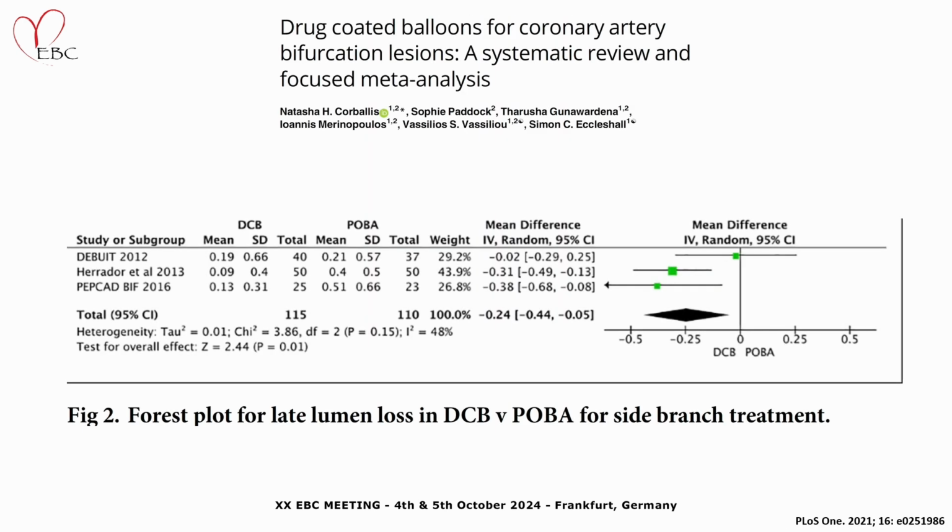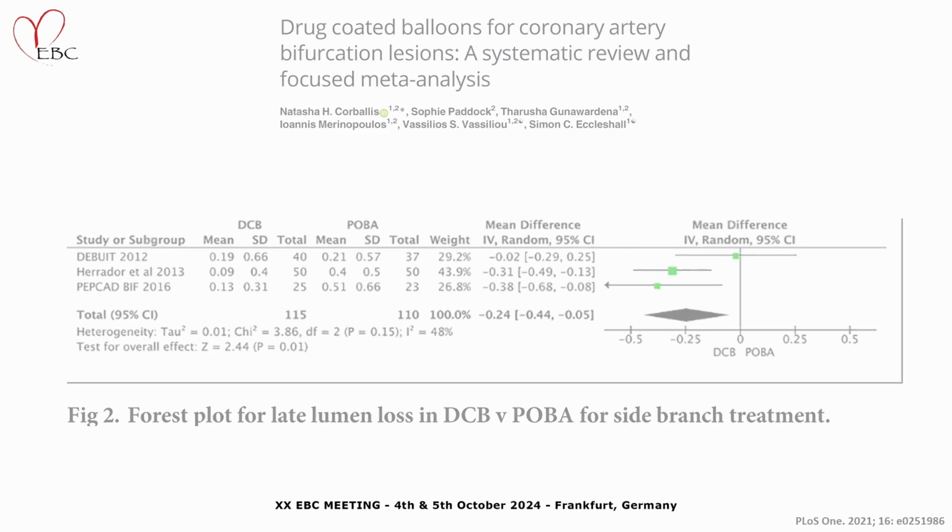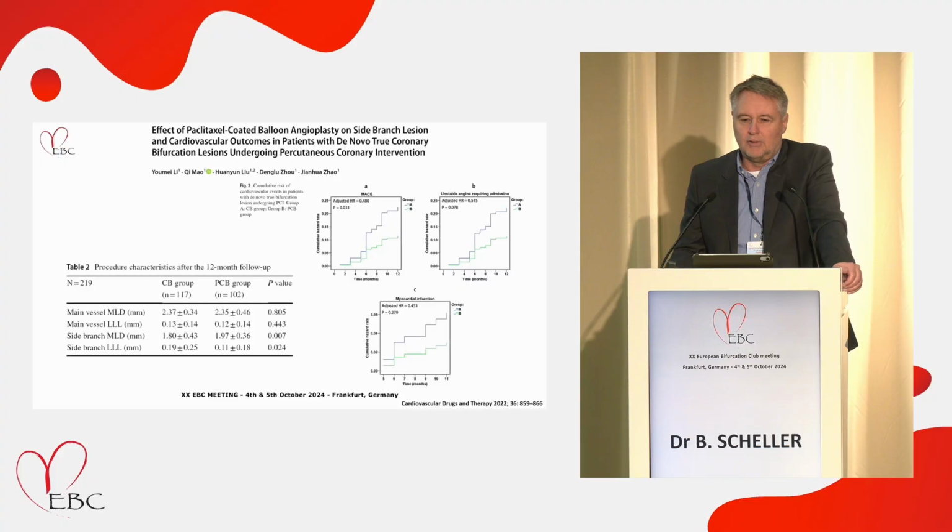This is a meta-analysis from Simon's group of the data available for the side branch treatment, and here you can see that there's an angiographic benefit when using a DCB instead of an uncoated balloon in the side branch. The question is, does this have any clinical relevance?